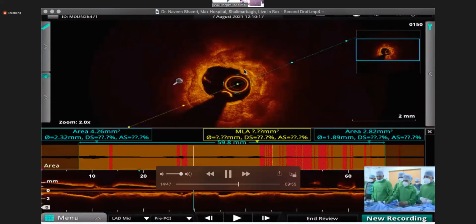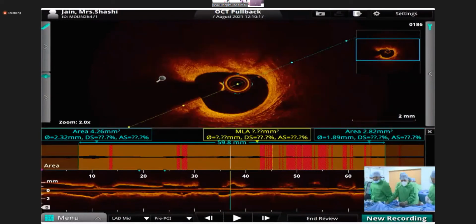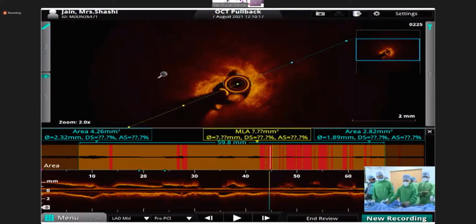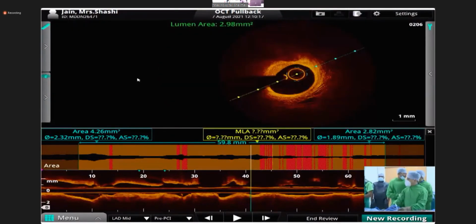I think we must use intravascular lithotripsy or shockwave lithotripsy, because of the circumferential calcium in this OCT image. You can see 360 degree calcium in this image. So we need to debulk further. What do you say, Sudhanshu and Devinder? Already we have debulked with the rota ablation and we have created space. Now we can see by this OCT image that a lot of intramural and extraluminal calcification is there and it is heavily calcified. So we need to debulk further. So IVL is needed in this case. I think that will be a better option.